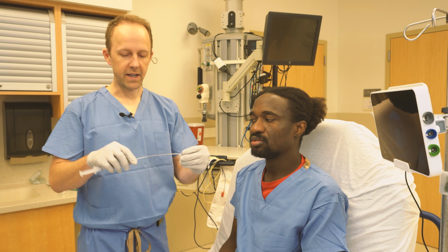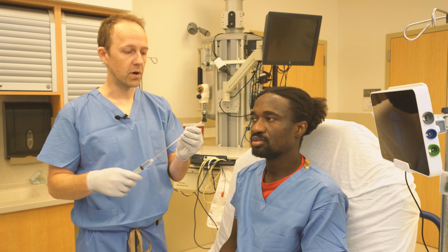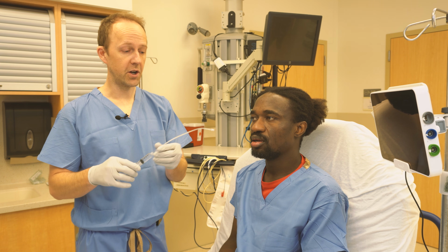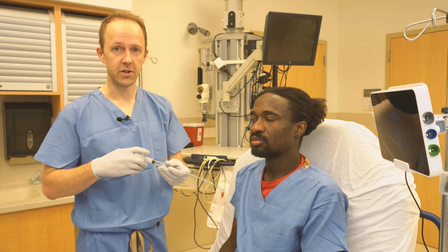Okay, and you want to just put a little bend in it because you're aiming to get the base of the tongue, the epiglottis, the vocal cords, all those periolaryngeal structures, but you're doing it blindly, so you don't know exactly where you're going, but you just want to get some anesthesia on there before you introduce the tube and the scope.